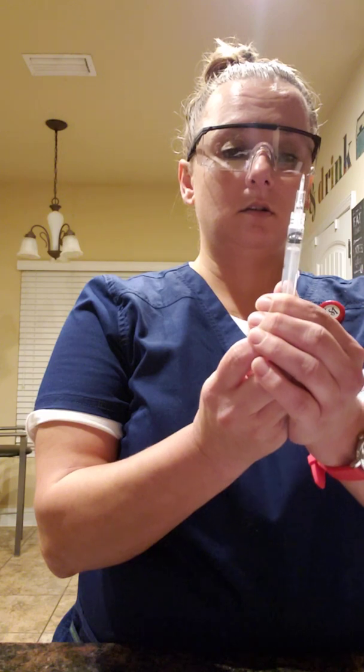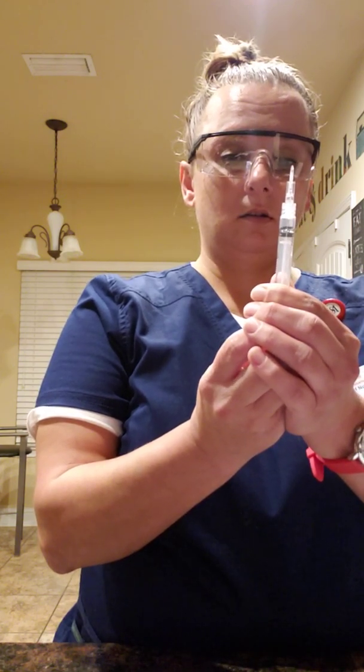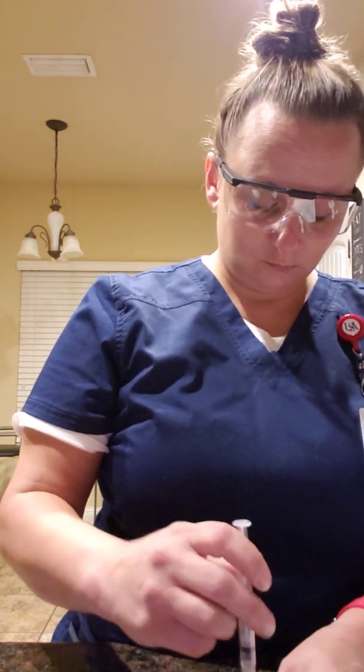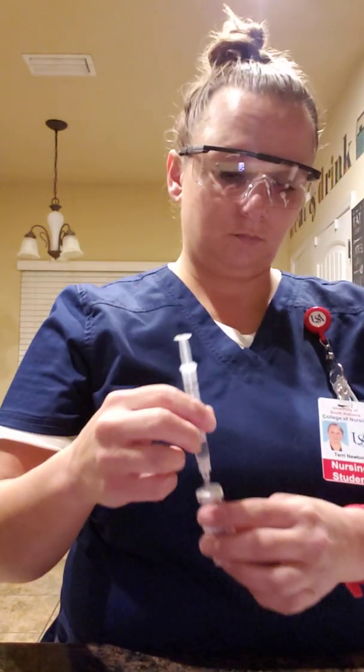I will draw back half a milliliter of air and push that in the vial and withdraw half a milliliter, making sure there are no air bubbles.